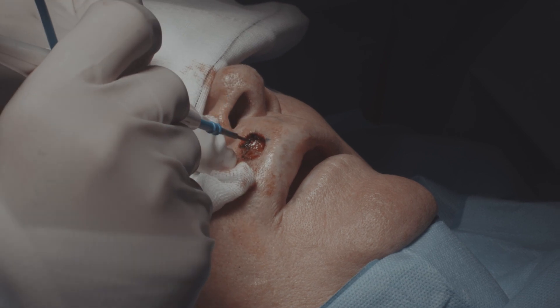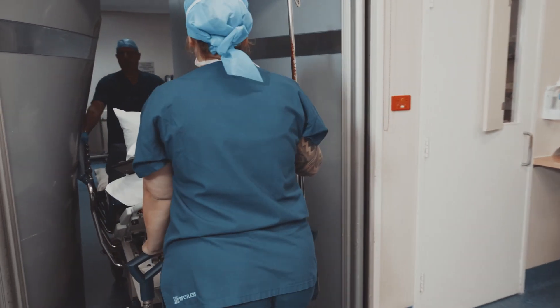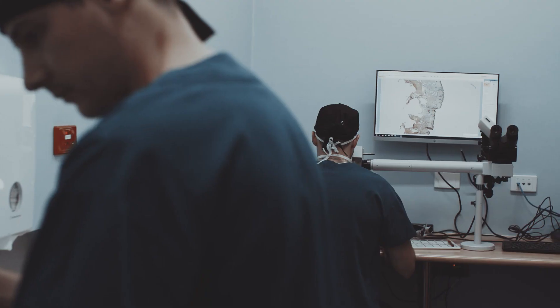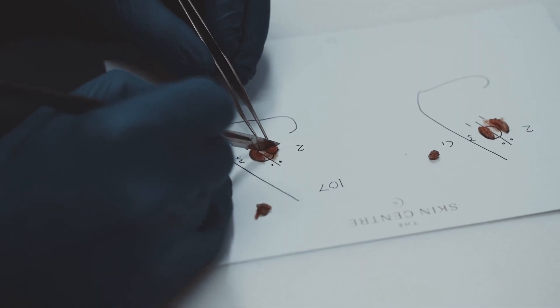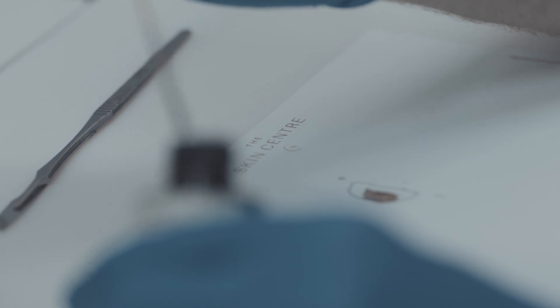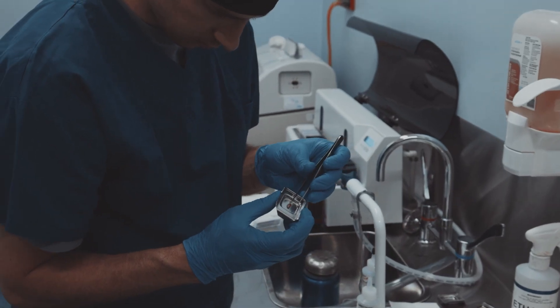Once we remove the tissue, we achieve hemostasis by cauterizing blood vessels to ensure there's no bleeding. We then put a temporary dressing over the top and the patient leaves the theatre into a special waiting area where they can have refreshments. The removed tissue is transported to the laboratory, where the Mohs surgeon — the same person who removed it — analyses it. We transect the tissue into quadrants, breaking the larger piece into smaller areas for greater accuracy and orientation, then mark the tissue with special dyes so it can be identified under the microscope.